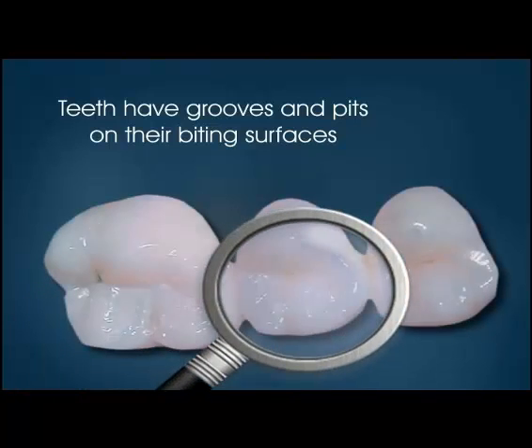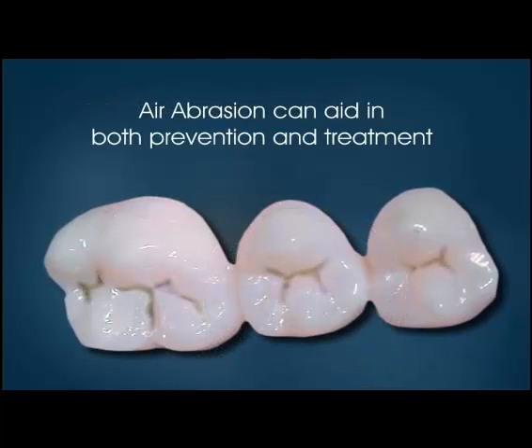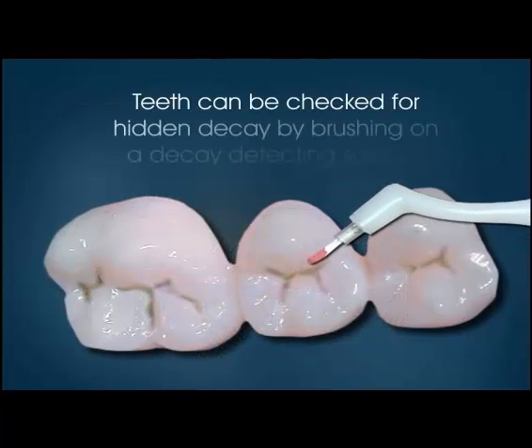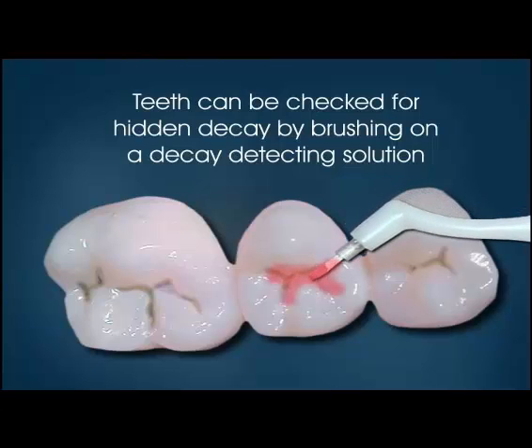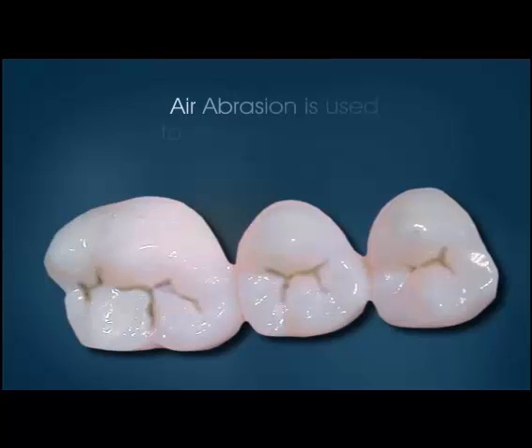Teeth have grooves and pits on their biting surfaces. Air abrasion can aid in both prevention and treatment. Teeth can be checked for hidden decay by brushing on a decay-detecting solution. After washing off the solution, if any grooves are stained red, decay is present. Air abrasion is then used to remove the decay.